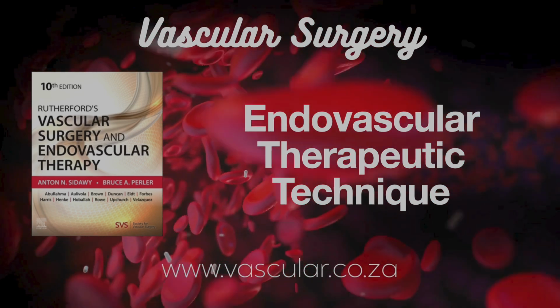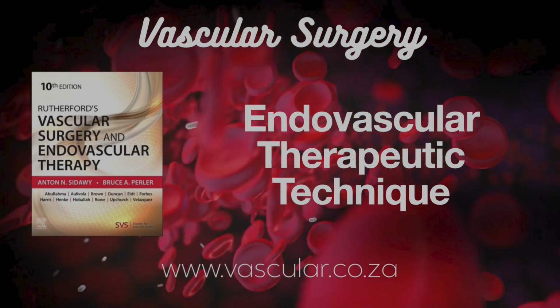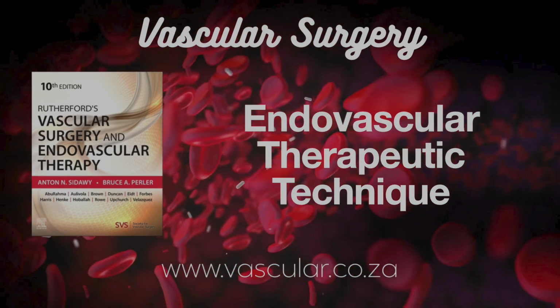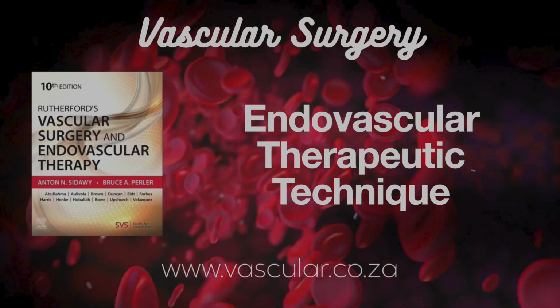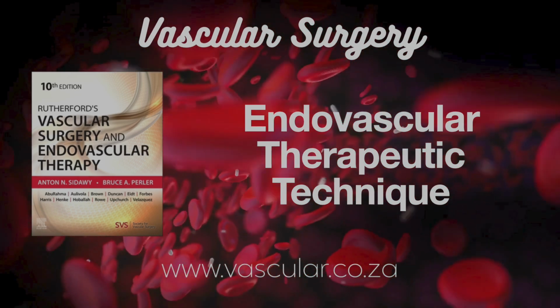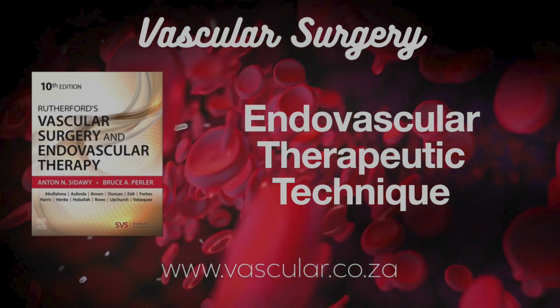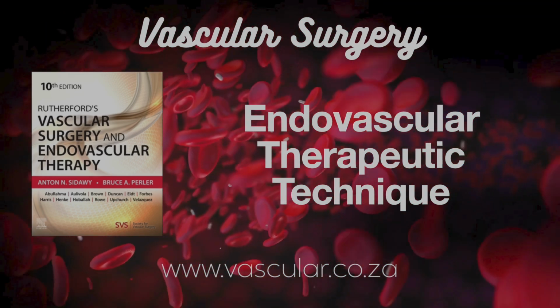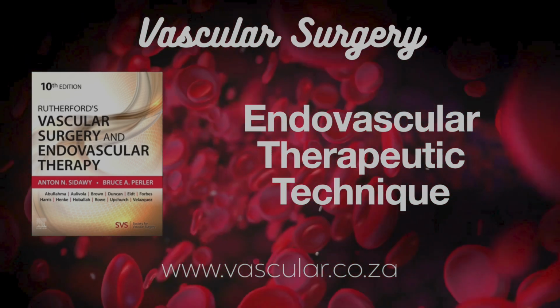And did the cold therapy pan out? Did it work? Unfortunately, not really. Reviews of multiple randomized trials comparing it to standard angioplasty generally haven't shown a significant difference in patency or restenosis rates. No clear benefit. Not consistently. There was maybe a slight hint of improvement at 6 months for in-stent restenosis in the SFA in one analysis, but overall, the evidence for a real clinical benefit is weak. Given that, plus the extra cost, its role seems pretty limited now.